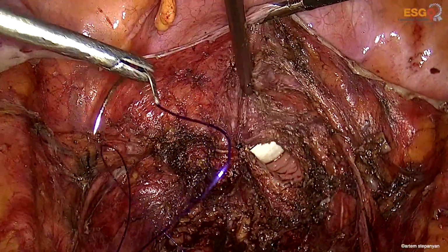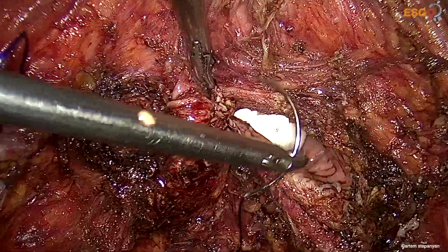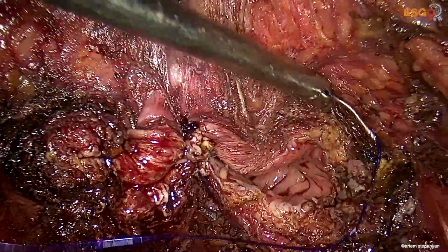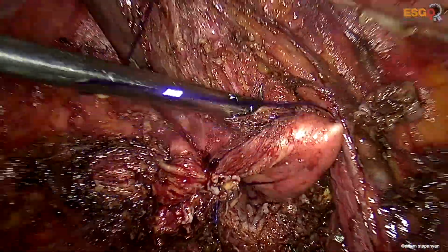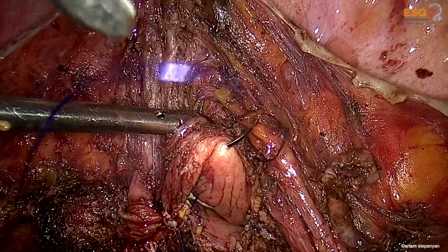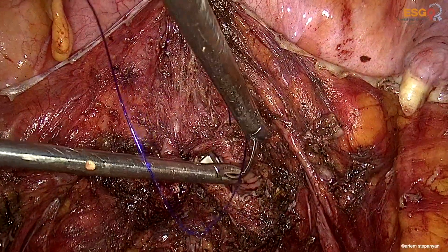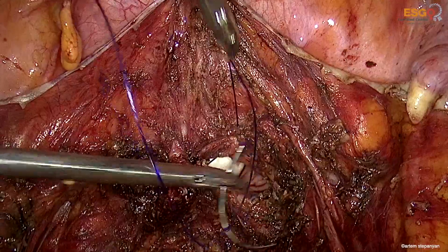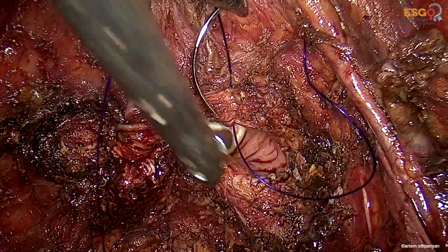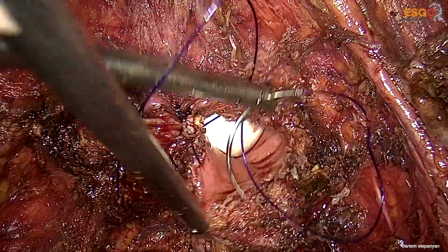And the vagina is closed by two resorbable monofilament sutures. One is already performed. This is the second one. And we believe that this is pretty enough to close the vagina in the standard hysterectomy cases.